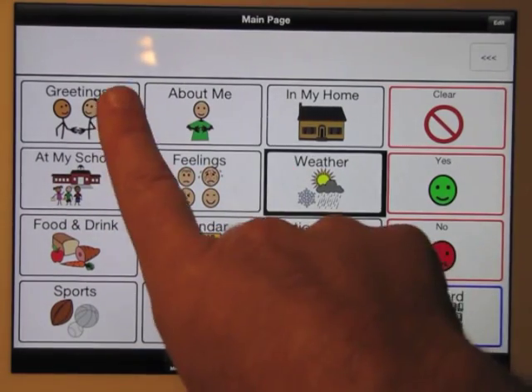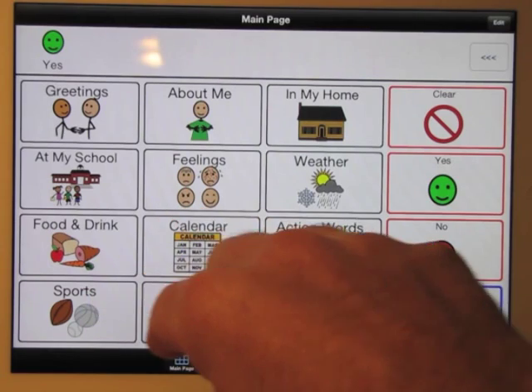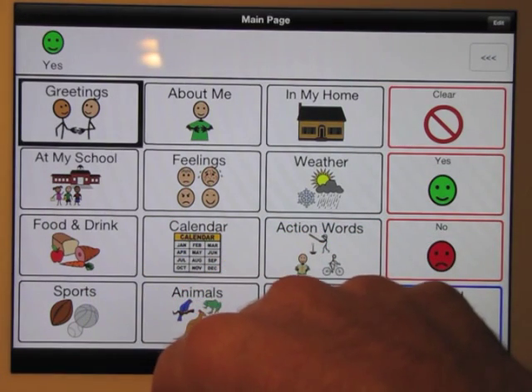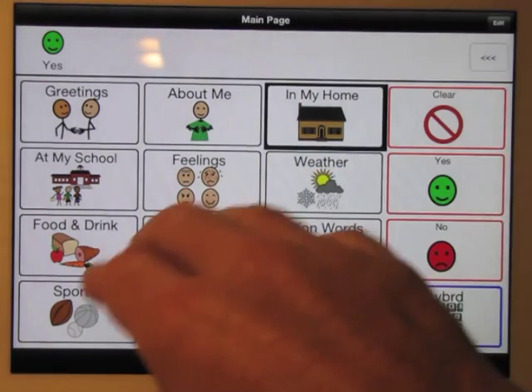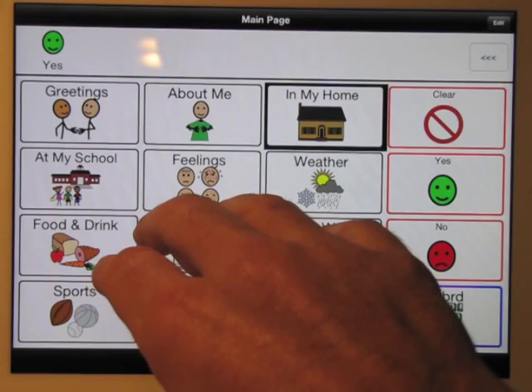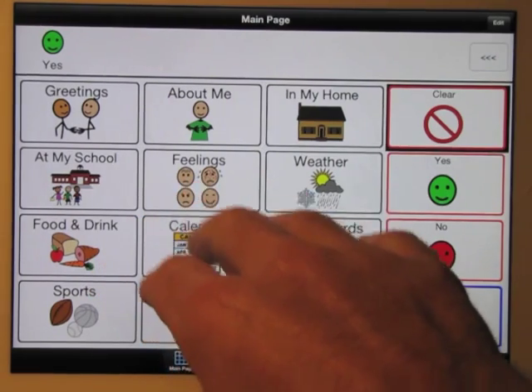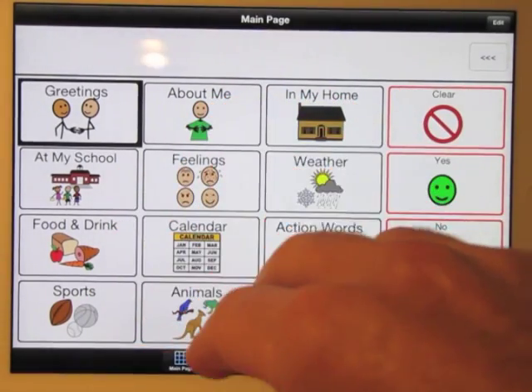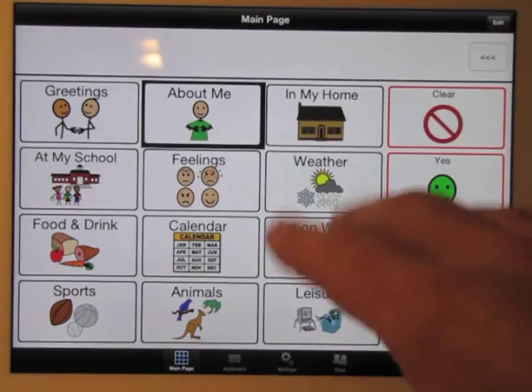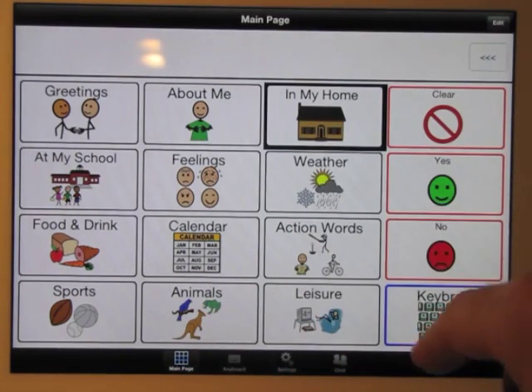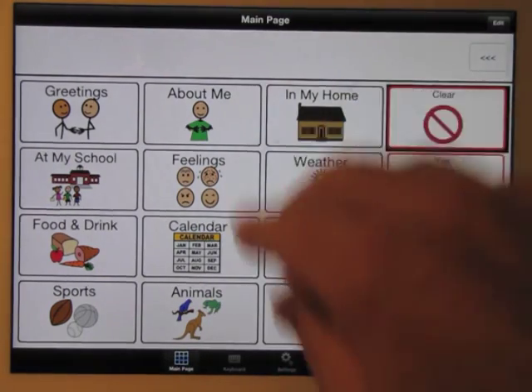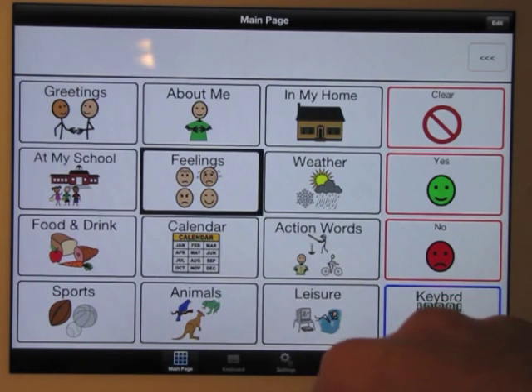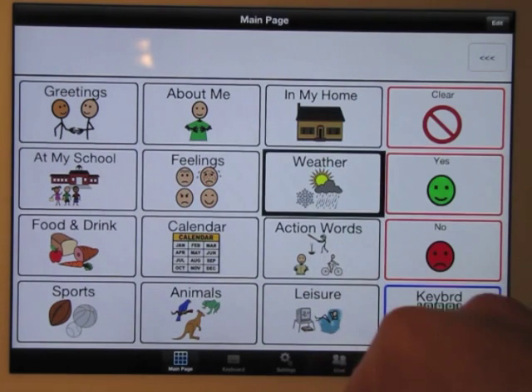I can touch anywhere on the screen — it acts as my switch. So if I wanted to hit 'Yes,' I just touch my screen anywhere and make my selection. If I wanted to clear it, I would just touch anywhere on the screen and make my selection. That is single switch step scanning — the user simply touches anywhere on the screen when it's on the item that they want, which is highlighted.